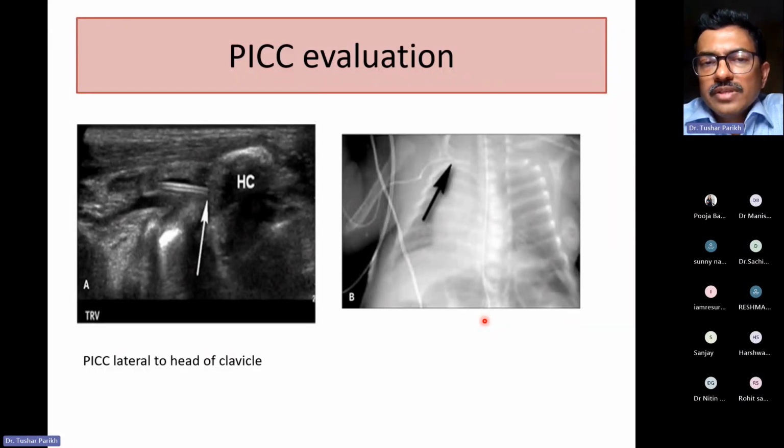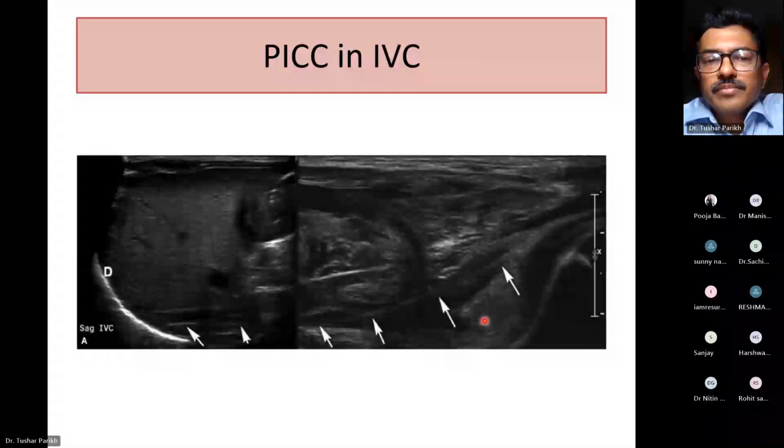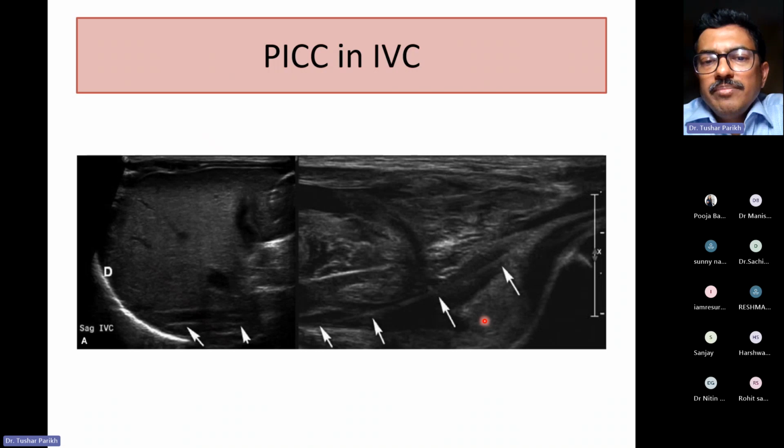Again, you have to follow the course of the line and look up to the tip of the line. One of the reasons that this has not become so popular is because it is difficult to visualize, and all things you'll not be able to see through lines. But again, this will require practice.